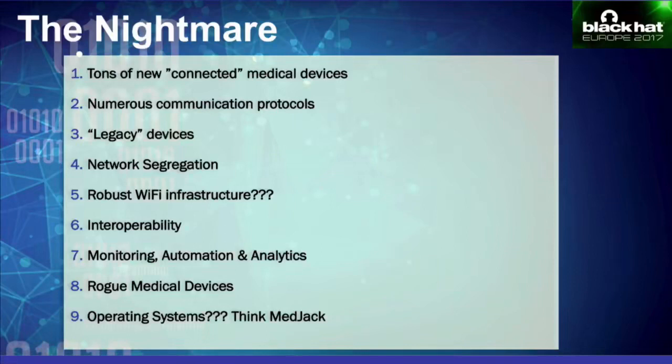These are your legacy devices that have older firmware. They've been around forever, but because they have a large lifespan, they are now being connected to the network. And the way these devices are being connected also presents a huge risk, and I'll talk about it in the next slide.